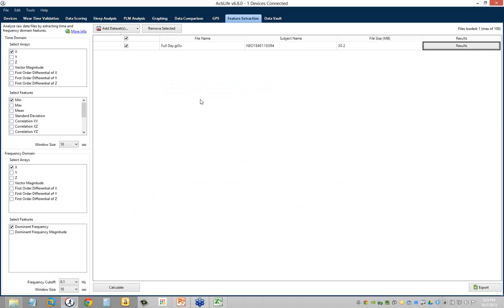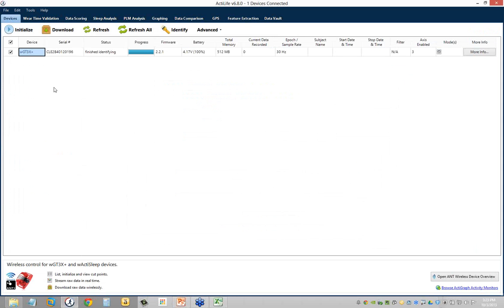So we've covered a little bit about the raw data. I didn't want to get too much into that today because that's a whole webinar in itself. I do want to talk about a couple other small features that you may not be aware of. So let's jump back to the PowerPoint just briefly here.